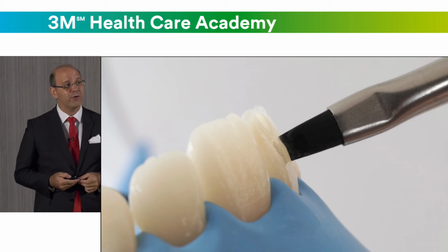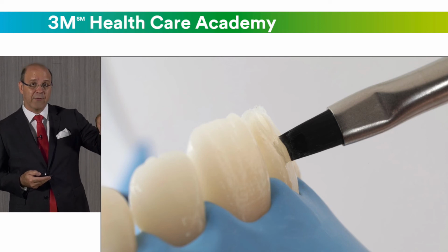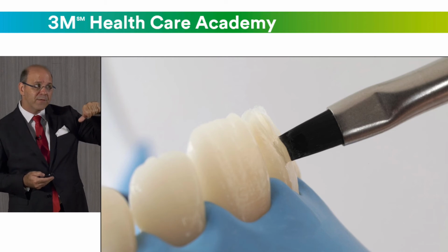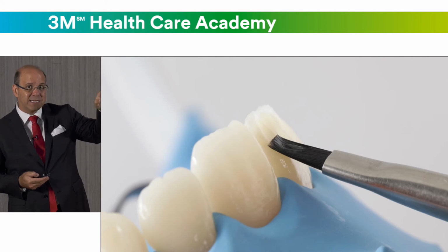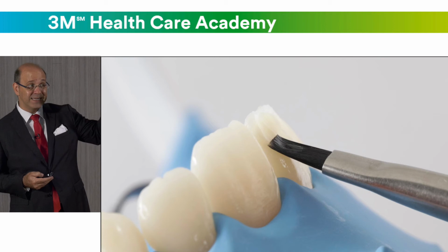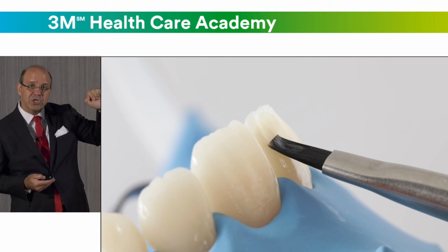You can use a brush and pass first the brush proximal to proximal on the bevel area. So just make a smooth movement with your brush, first proximal to proximal, and then push from the dentin to the bevel. So when you push the dentin to the bevel, it's like your dentin yields the continuation of the bevel to the incisal. So the dentin should touch and go on top of the internal part of the bevel and make a very smooth continuation.